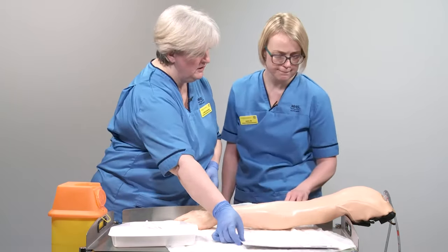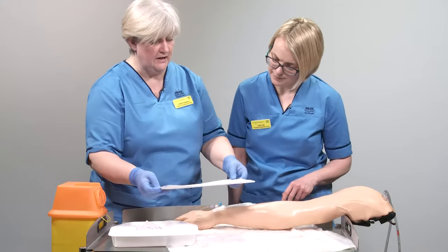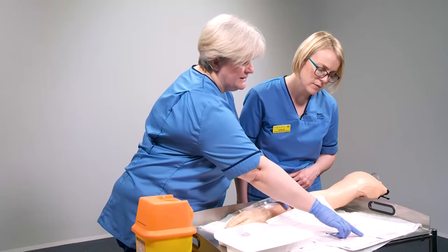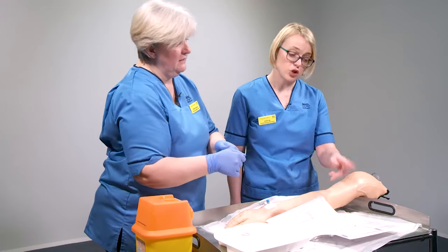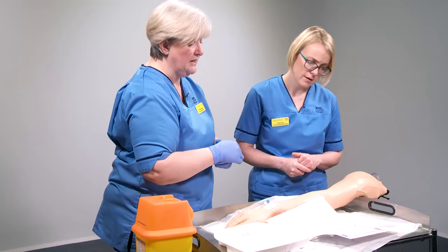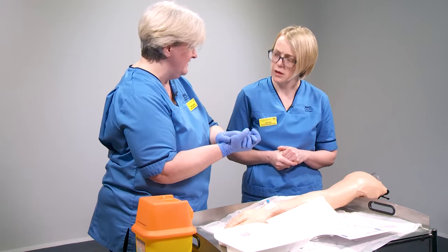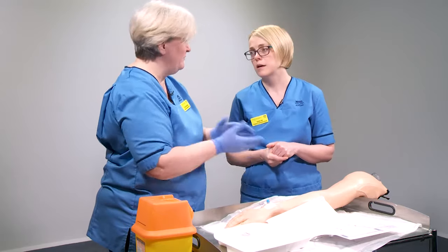The next thing to do is record in the drug kardex that the medication has been given — both practitioners need to sign to confirm it's been administered, so that's two signatures in the drug kardex. Then remove gloves and perform hand hygiene again because we've been in a patient space.